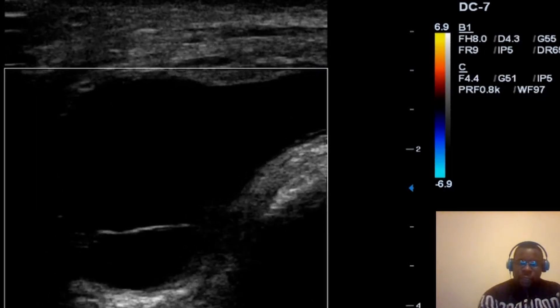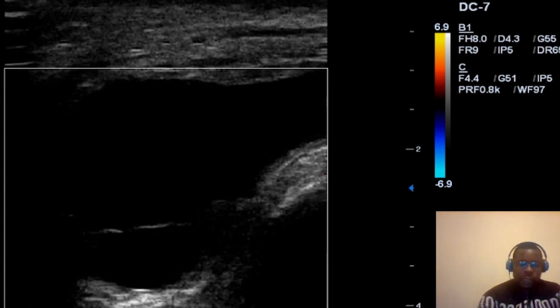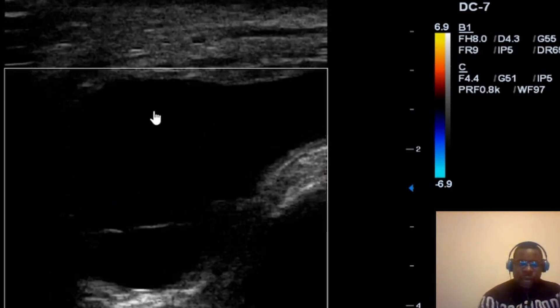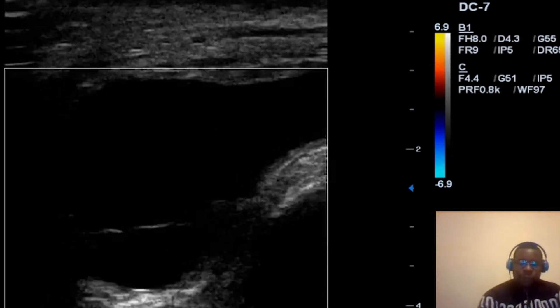On color Doppler interrogation, you can appreciate the collection that we have here. We don't see any sign of color flow on Doppler — there is no flow in this collection. So we can rule out bursitis, which is an inflammatory process. With inflammation we would expect to see hyperperfusion, but in this context there is no perfusion.